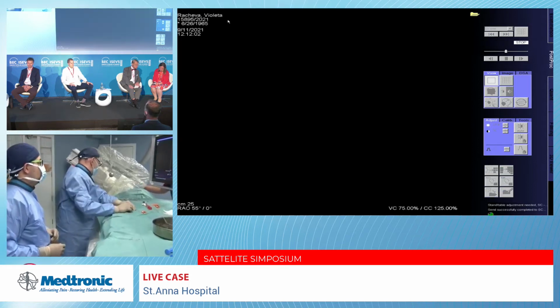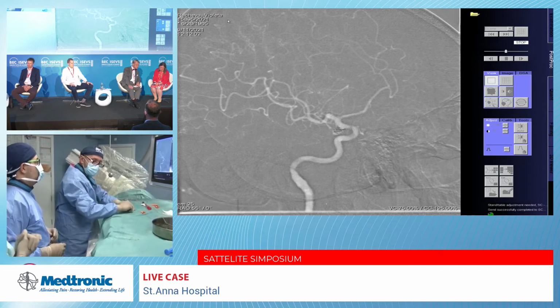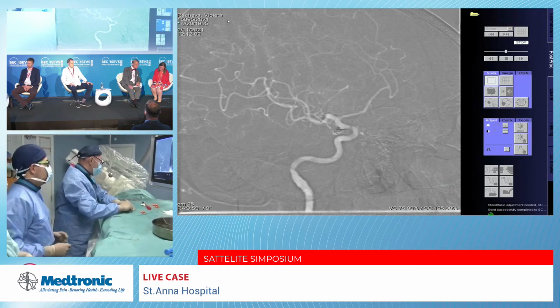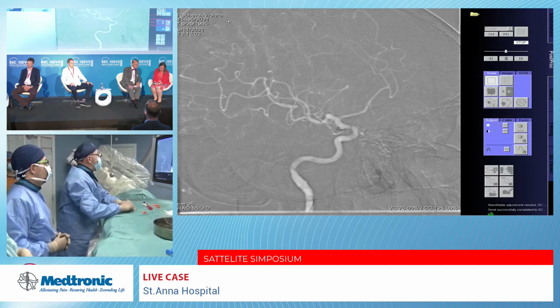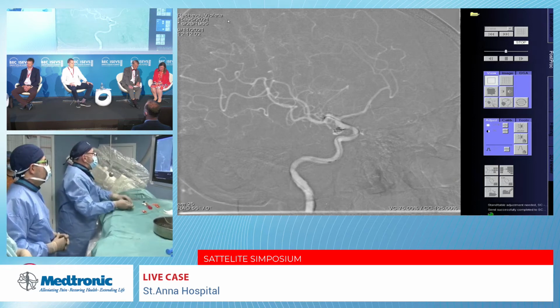Yeah, correct? Your hand. Okay. We're going up. Here is the stent. Okay.